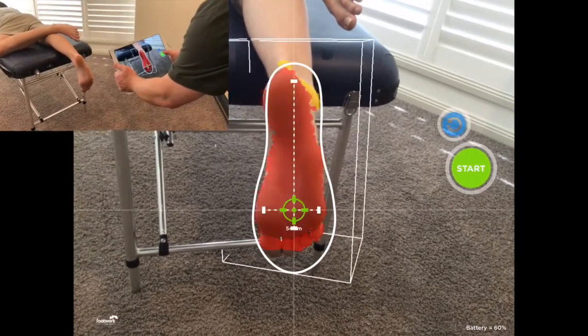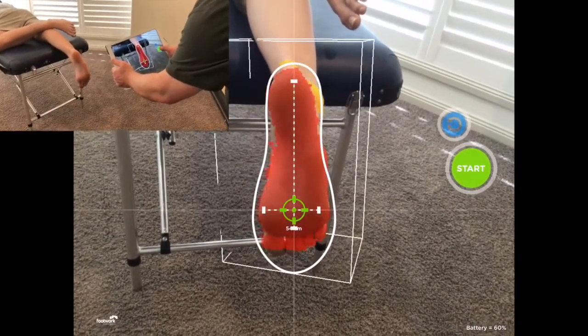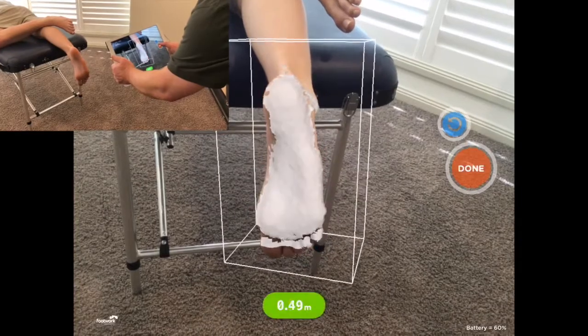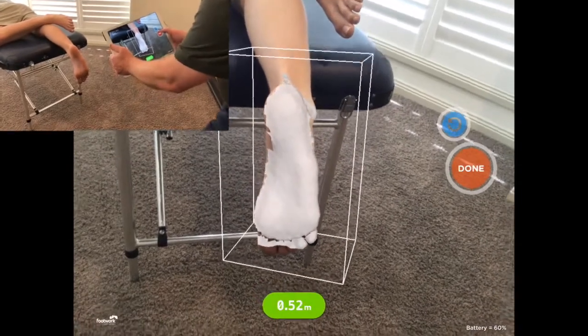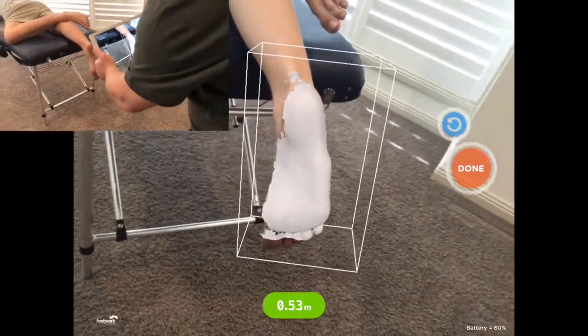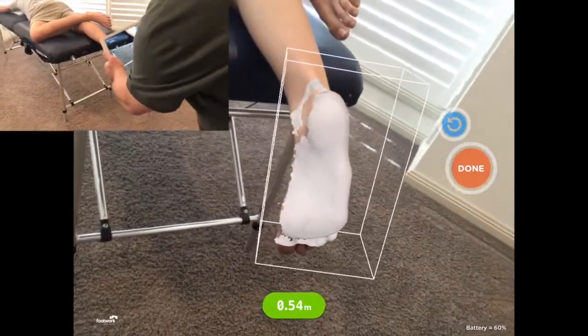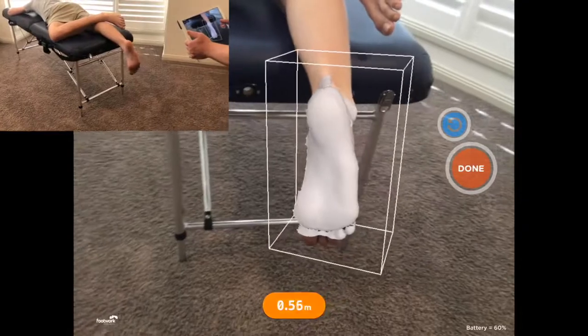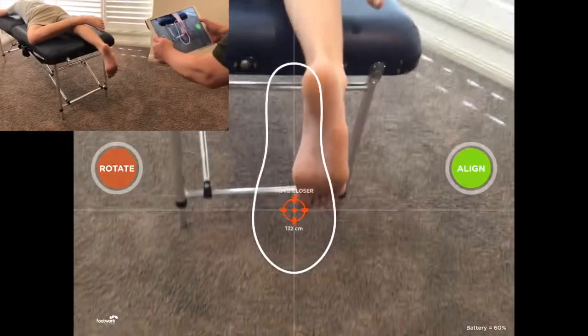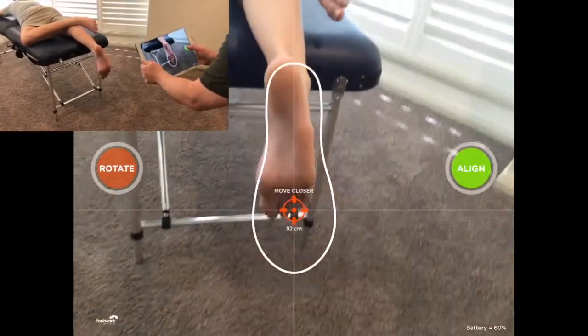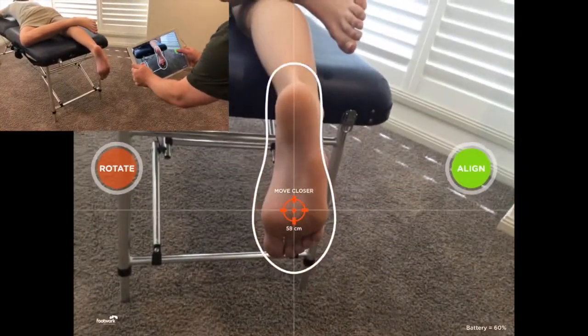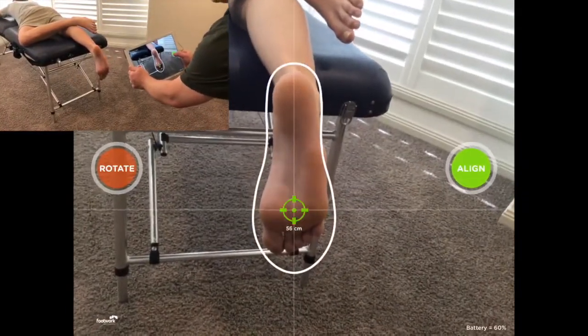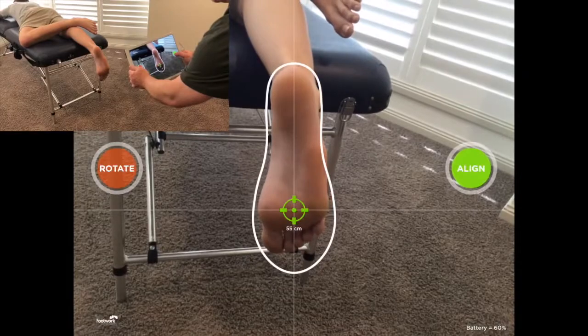As you can see, this one I aligned a little bit too high, thus cutting the toes off, so I press Reset and go again. We want to see the toes, the full foot. I press Align and start again, and now I have a nicely sized-up foot.